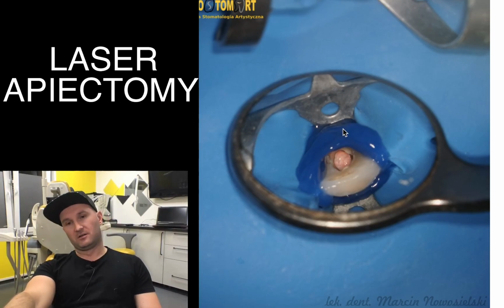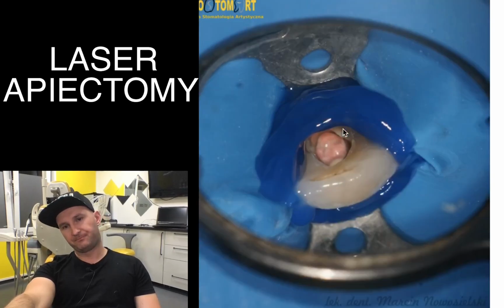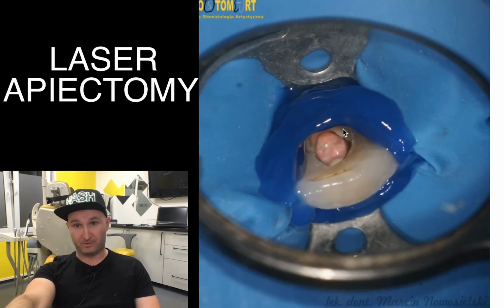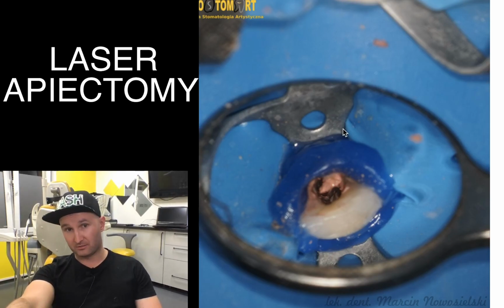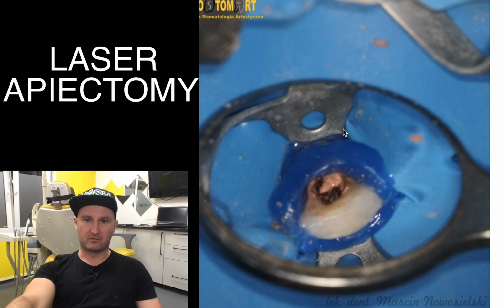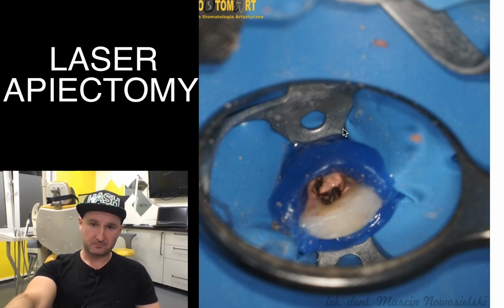Okay, so after that we removed the gutta percha with ultrasonic tip. In fact, it was perio tip, long and thin. I don't remember the exact number of it, but it was perio tip. The removing of it was done with water irrigation, and this is how it looks.